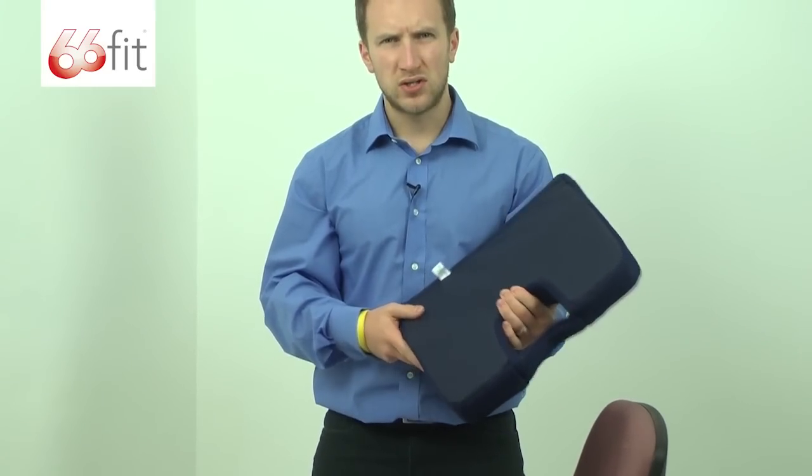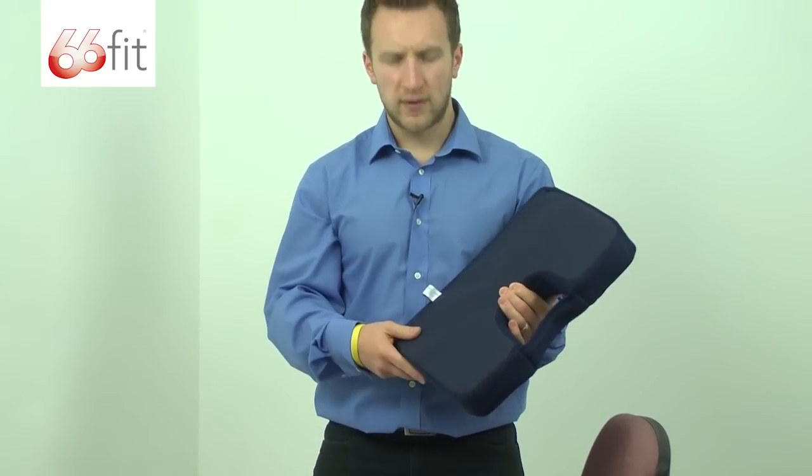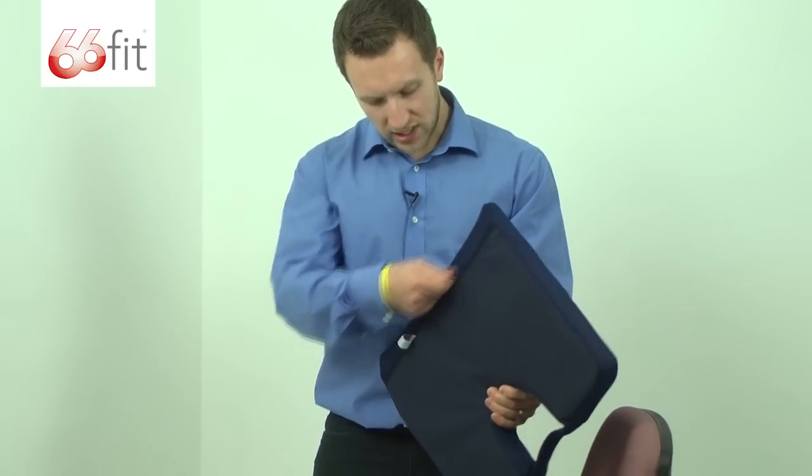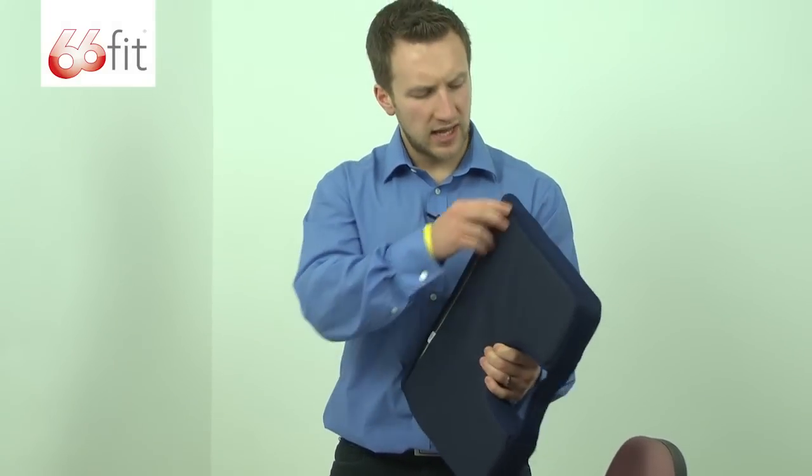We're using this office chair here, but you can use a car seat, office chair if you are at work, or a normal chair at home. We've also got a zip — you can take the outer layer off and if you want to hand wash that or put it in a washing machine, you can do.